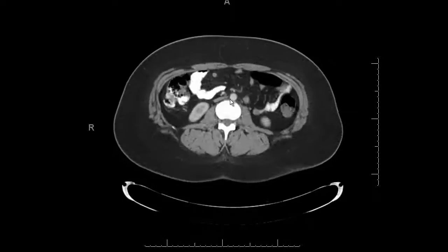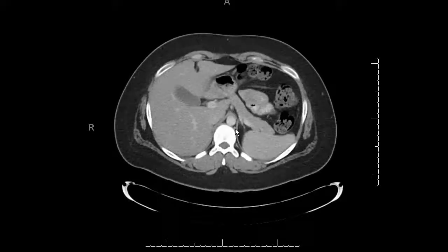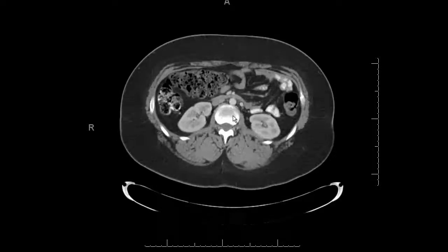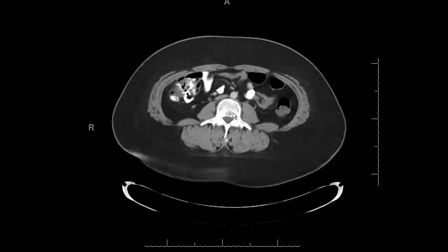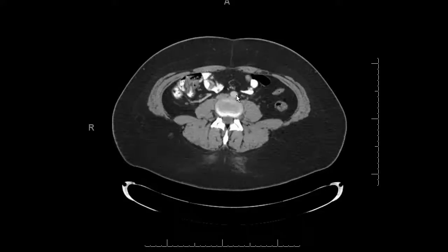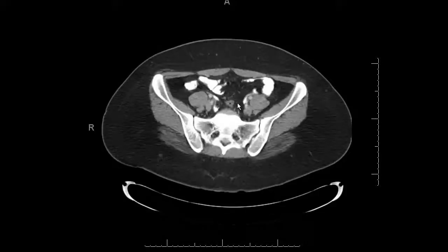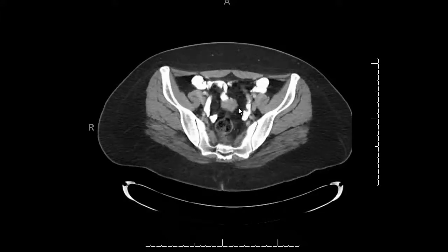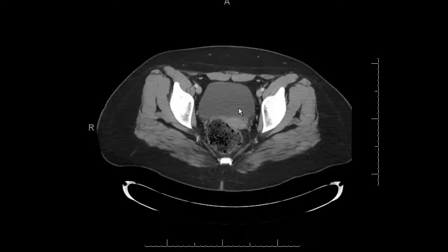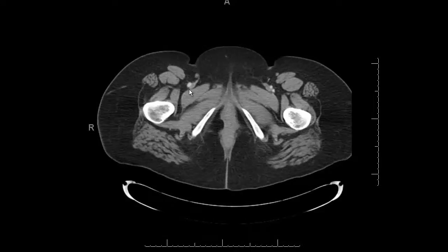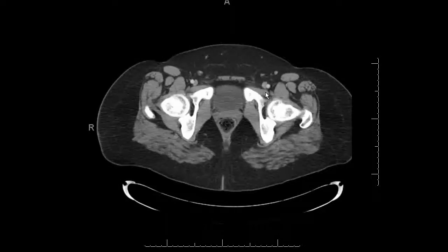Also look at the SMA coming off the aorta and scroll down until you see a branch to the mesenteric bowel. Then follow the whole aorta down, catch the IMA — which will pop off — and the bifurcation. You're looking for atherosclerosis. Follow the iliac arteries all the way distally and you'll also see the femoral and iliac veins.